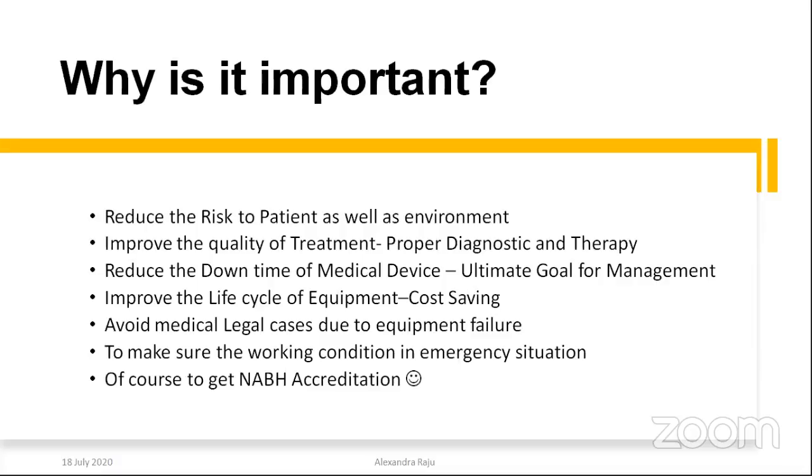Next slide, sir. So what is the importance of calibration? Calibration reduces the risk to the patient as well as the environment. If the equipment is functioning well, the patient risk is less, and the patient will be getting safe and quality treatment. It improves the quality of the treatment, so proper diagnostics and therapy can be given to the patient. Calibration also reduces the downtime of the medical devices.